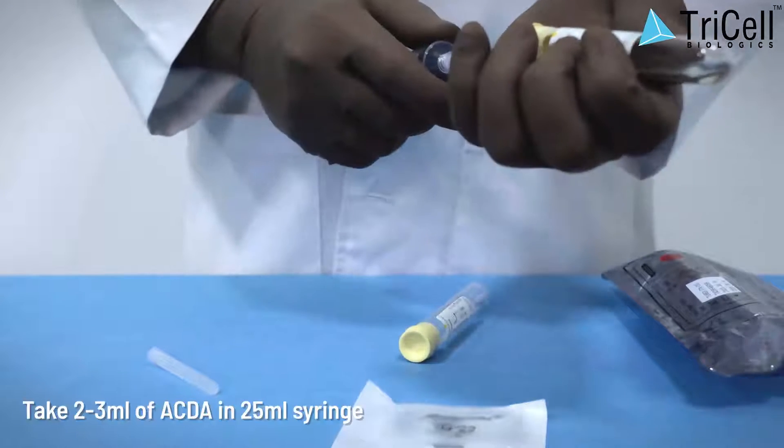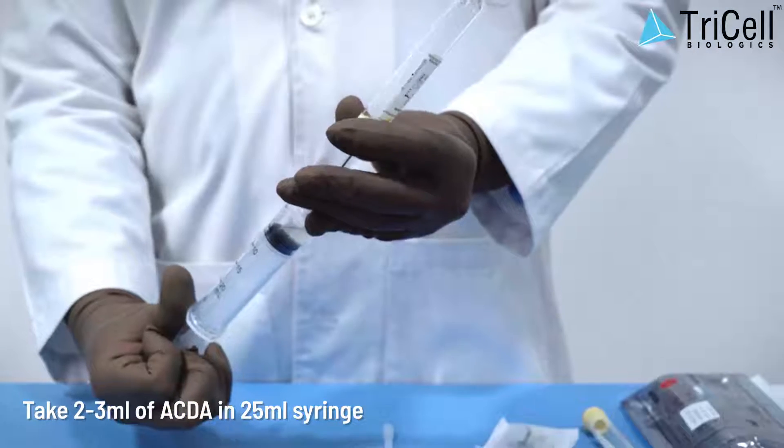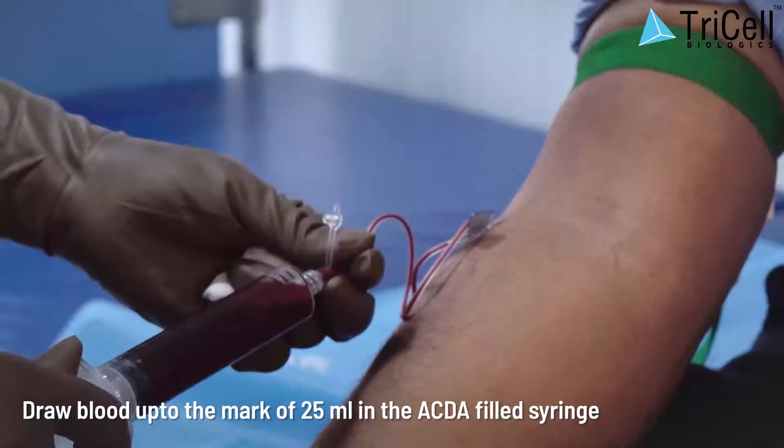Step 1: Take 2 to 3 milliliters of ACDA in a 25 milliliter syringe. Step 2: Draw blood up to the mark of 25 milliliters in the ACDA-filled syringe.